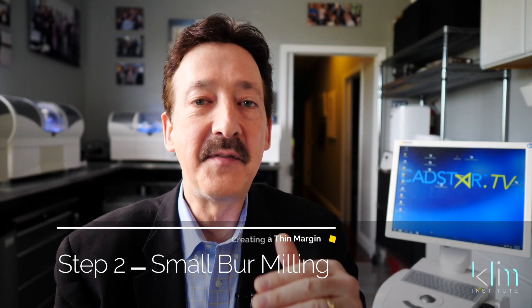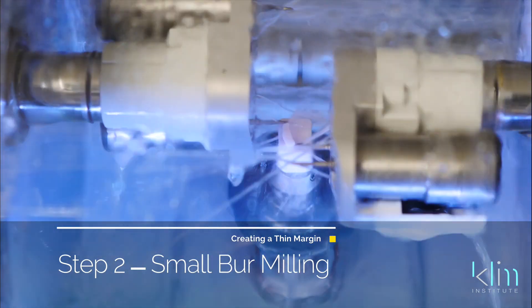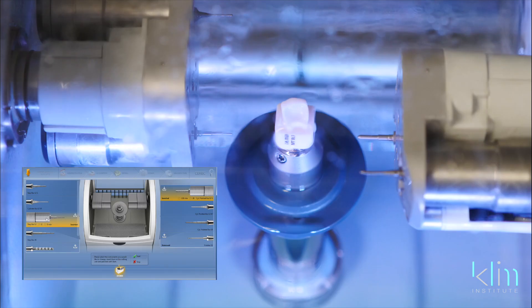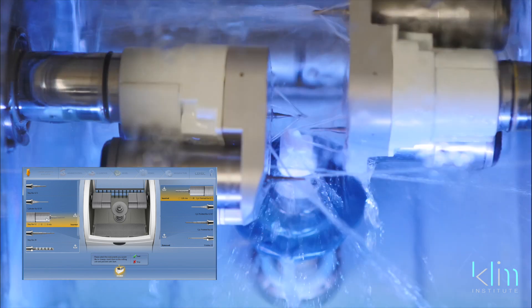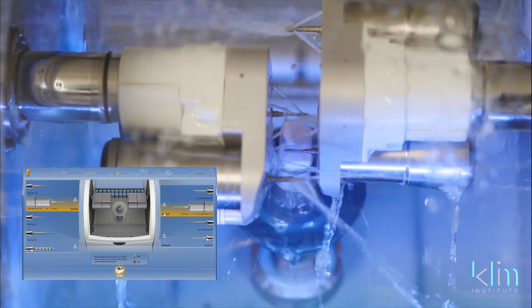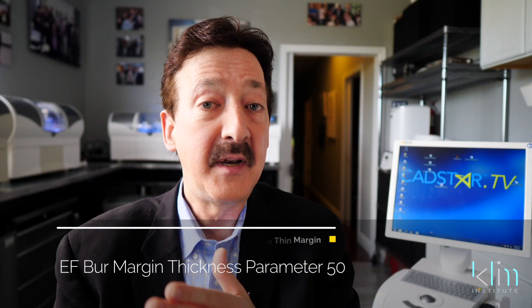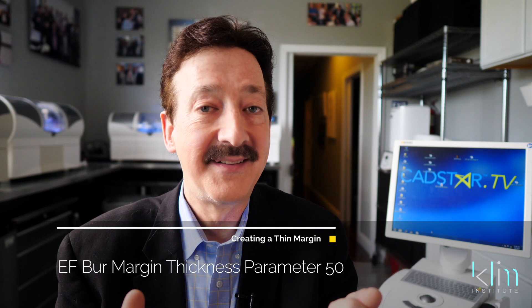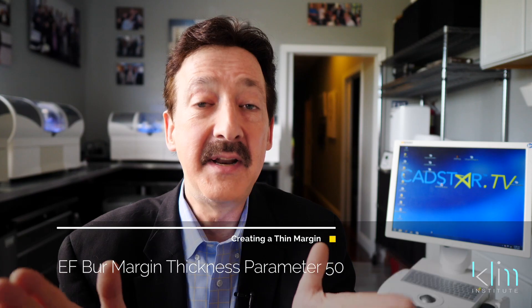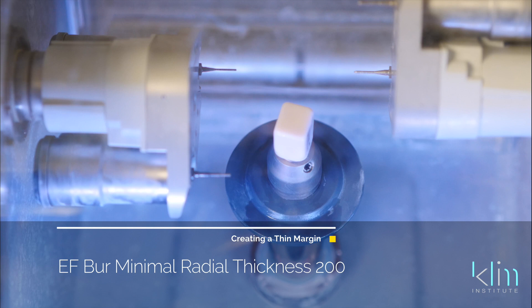Step two is understanding how the MCXL will mill. In my situation, I have four engines — two engines on either side — which allows me to use the EF burr system. The initial mill is with a larger burr system like the S or just the standard 12, and then the final component of that mill is with the really small burrs. As a result, you get those clean, pressable margins. My marginal thickness parameter when using EF burrs is 50, and my minimal thickness is 200 microns — that's with the EF burr system.